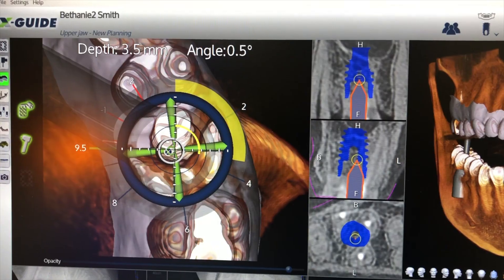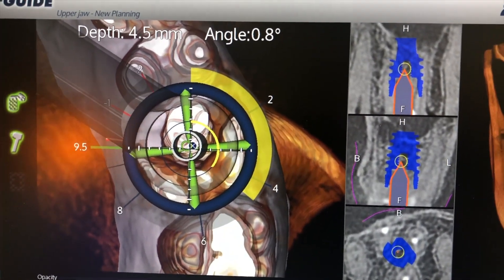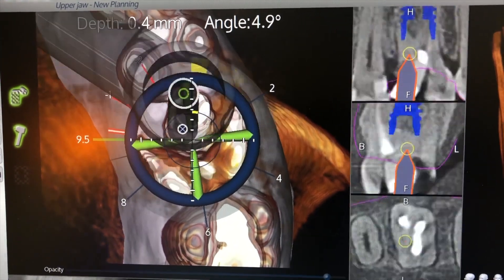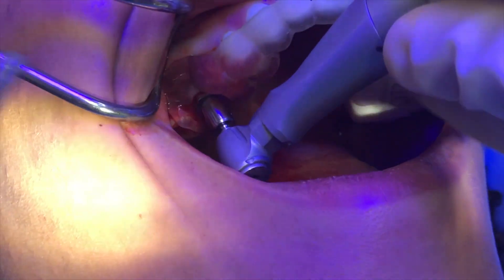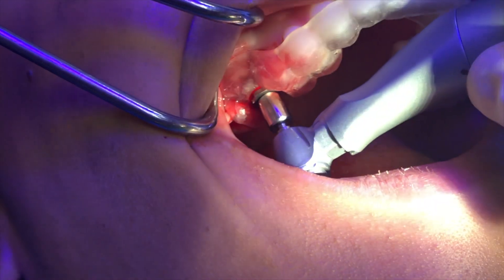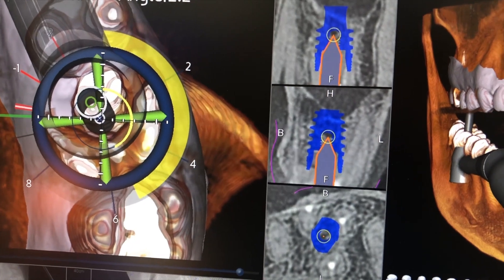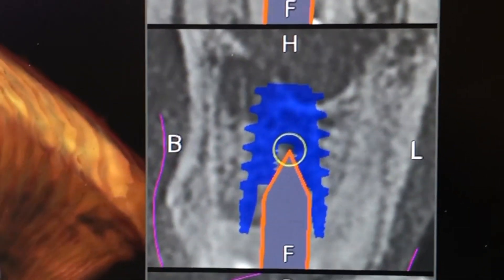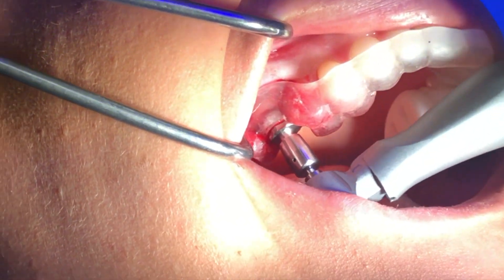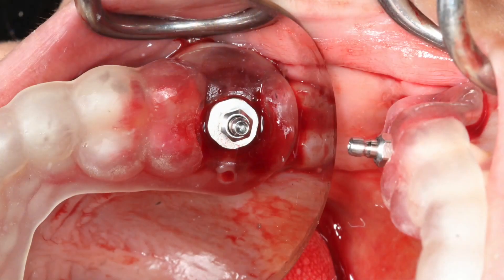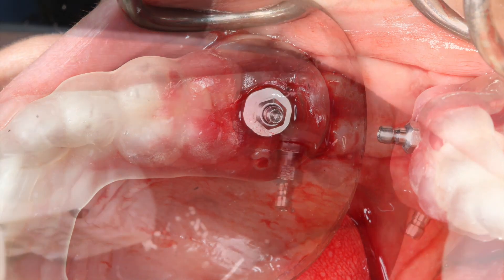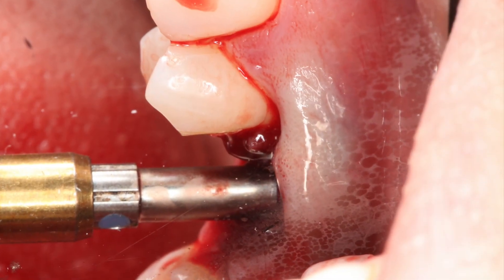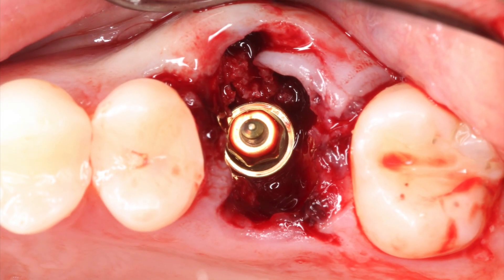The surface is different based on where it's being used — at the apex it's a little bit rougher, and as you move up the implant it does change, but it's all anodized. The color changes at the top, which is partly for restorative help but also designed to reflect how soft tissues respond. As the implant goes in, we can see the target is still being maintained. The plan transferred from DTX Implant Studio into the X-guide software is sophisticated. With the template down, the final implant position is confirmed — three millimeters below the tissue, right where we want it for good healing.